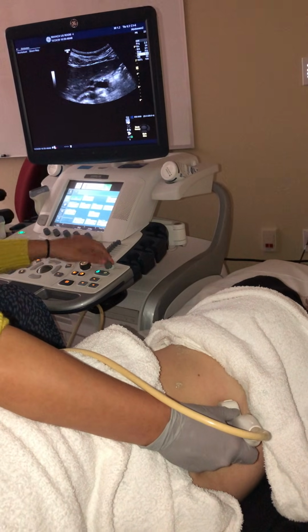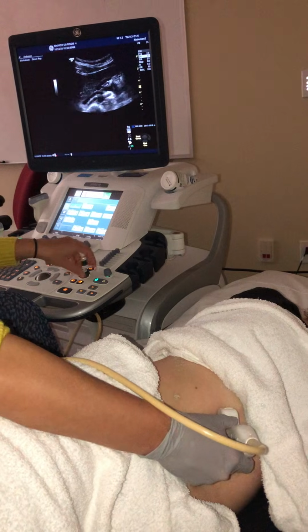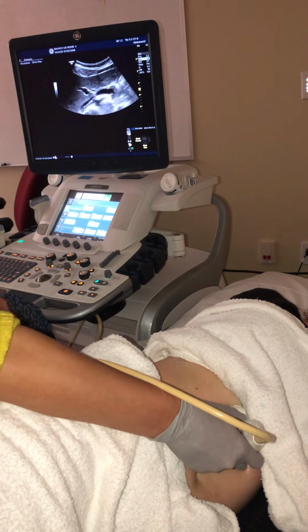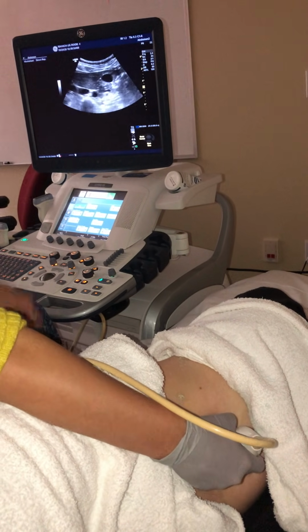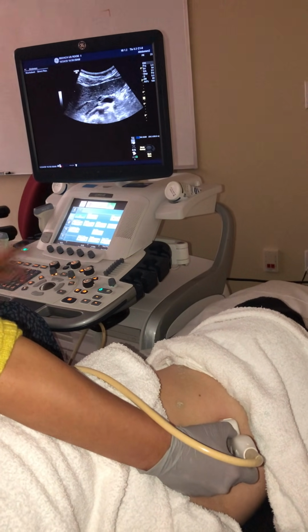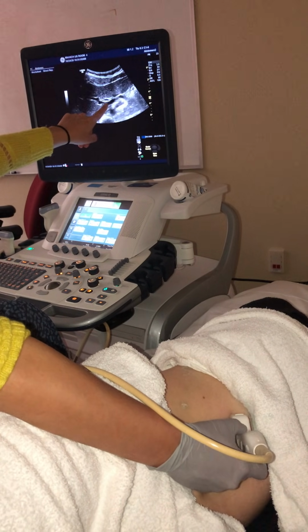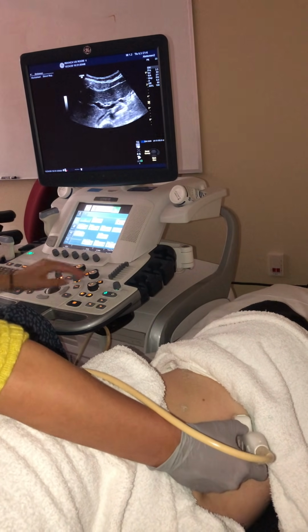If you can't find the common bile duct while the patient is supine, you could try to attempt it with them in a decube position as well. You're going to do the same thing. You're going to find your transverse gallbladder. You're going to sweep up a little bit under her rib cage so you get to the porta hepatis. You're going to find your portal vein and your hepatic artery, and you're going to be looking in that region.